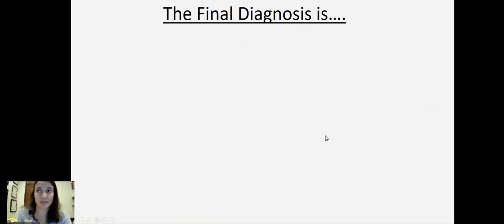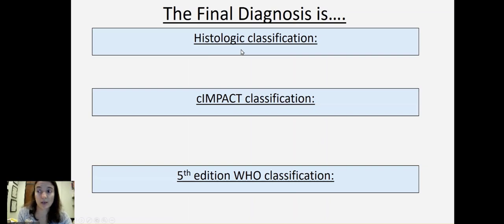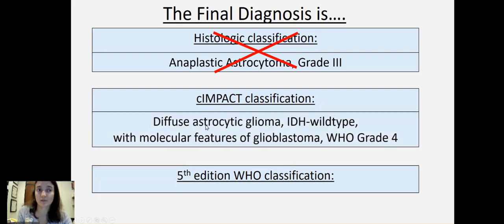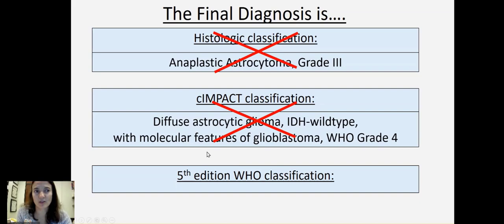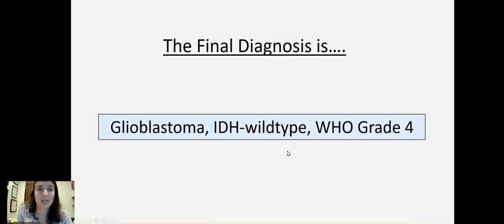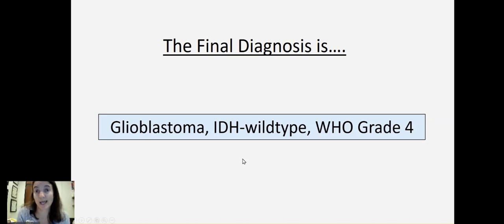For the final diagnosis — if we're going by the histologic classification alone, we would call this an anaplastic astrocytoma grade three, but that's not recommended. If we go by the C-IMPACT classification recommended since the fourth edition of the WHO, we would call this diffuse astrocytic glioma IDH wild type with molecular features of glioblastoma, which is a mouthful. In the fifth edition, instead of calling it molecular features of glioblastoma, since these tumors are going to act like a glioblastoma, we just call them a glioblastoma. So the final diagnosis is glioblastoma IDH wild type, even though on histology it looked like anaplastic astrocytoma — we can upgrade it to glioblastoma based on its molecular features, because that's the way it's going to act and the way it should be treated.